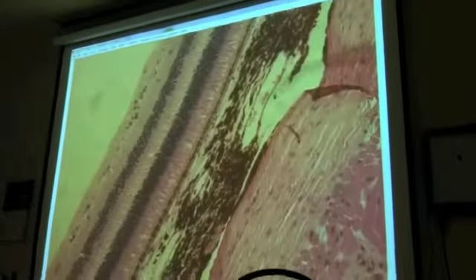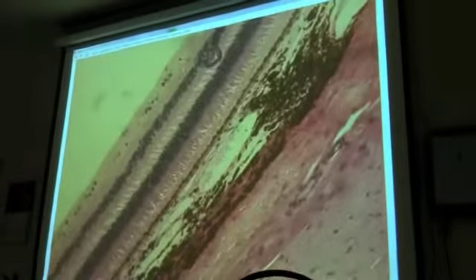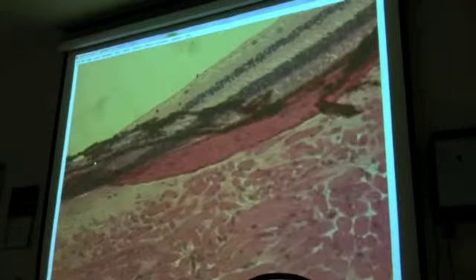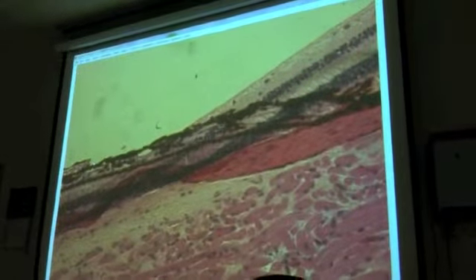See that the retina is going to thin out. Oops, got out to the muscle. Okay, right about there, we're losing the retina. Not quite. We've got a little bit of destruction there. We still have some retina there. It's shorter. We have some destruction here. All right, retina's still going.